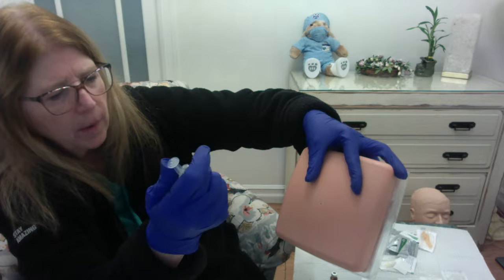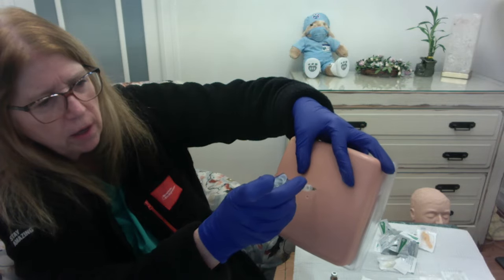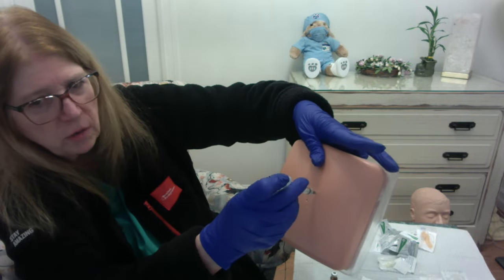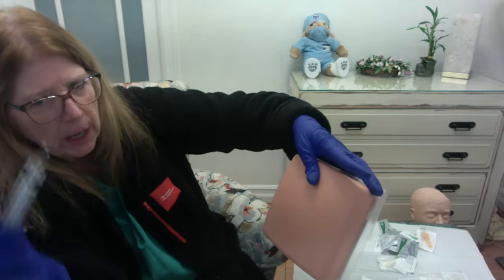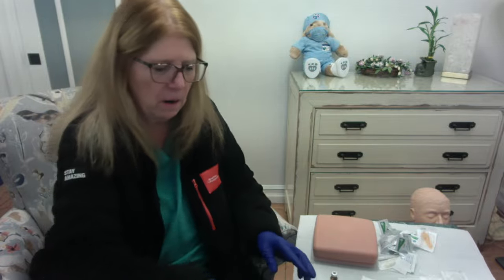So again, spread, inject, check little aspiration, no blood, inject, release, out. Sharps container, no recapping, okay? Very important. Okay, so that's our routine or regular IM injection.